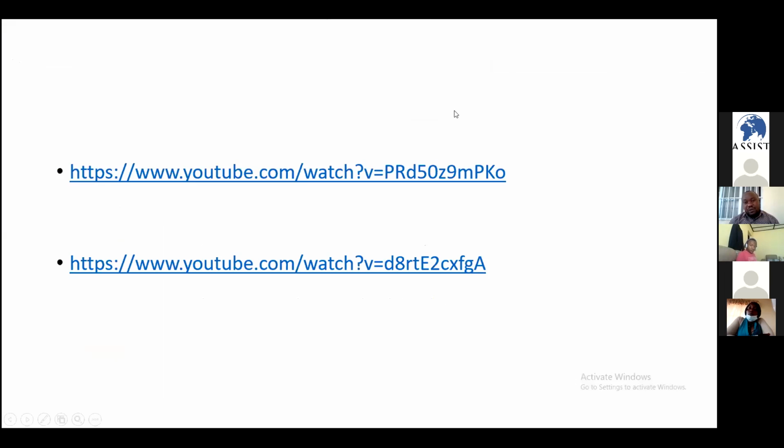You should know how to do data interpretation by considering the probe placement, and by removing all artifacts created by artificial and polished nails. Our patients currently may come to us with polished nails or artificial nails. What will we do? You take all those things into consideration while doing your data interpretation.